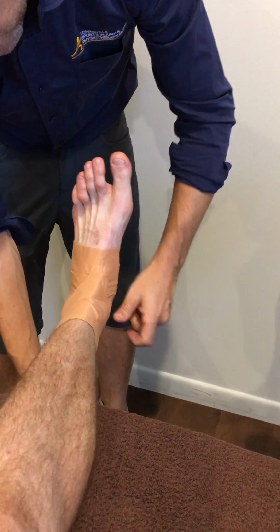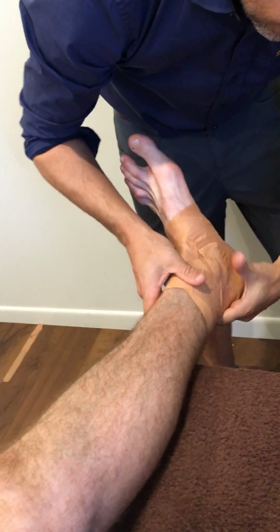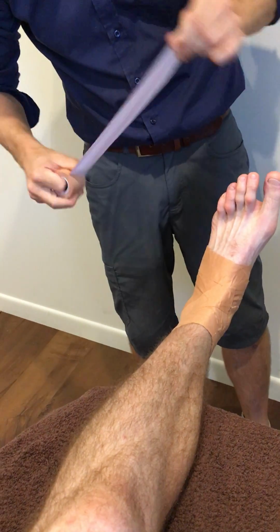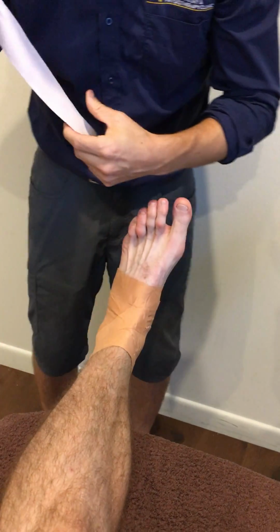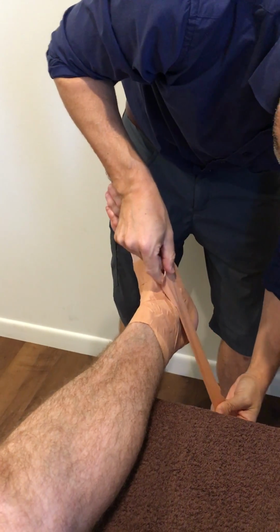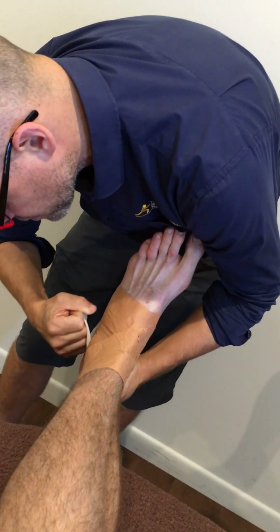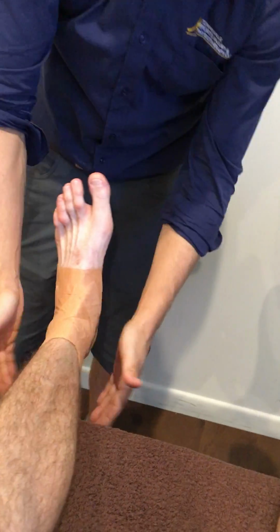Sometimes just getting the angles with the ankles as well. Try to go with the contours of the body. You'll get used to doing it after you do it a while. Do a few. Sometimes they'll fold over and sometimes you'll get a good job. But this one is more of a straight one around. And there you go.